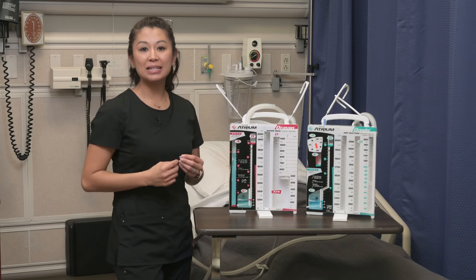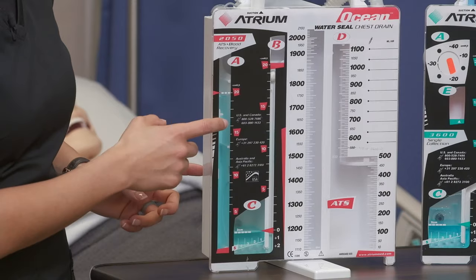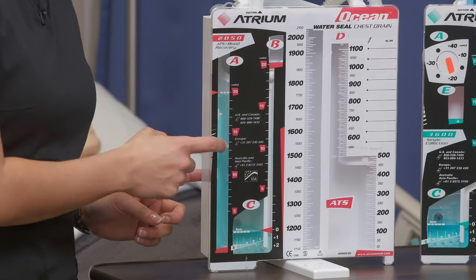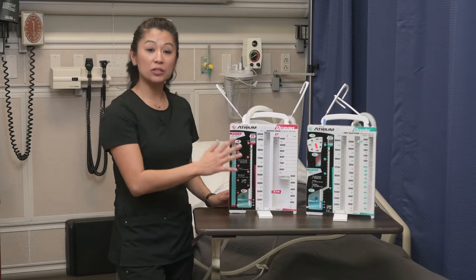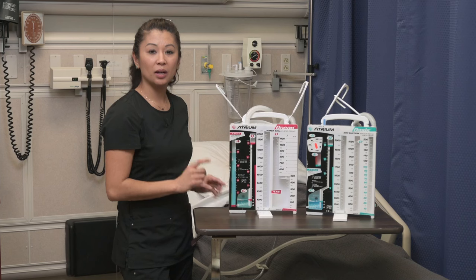When the wet canister is set up to suction, don't be confused — you should see some gentle bubbling in the suction control column A. That is normal when suction is applied. Those are the main components you're going to see in regards to these chest tube canisters.